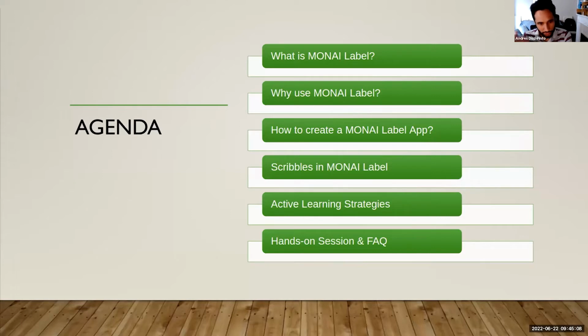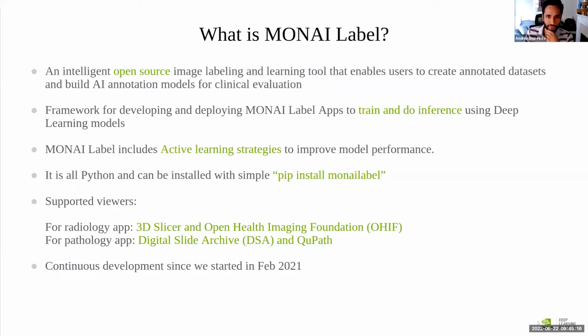And then the last bit will be the hands-on session and the frequently asked questions. I prepared a bunch of questions that I usually get from the users, and that's the bit that I'm going to follow. So briefly, what is MONAI Label?